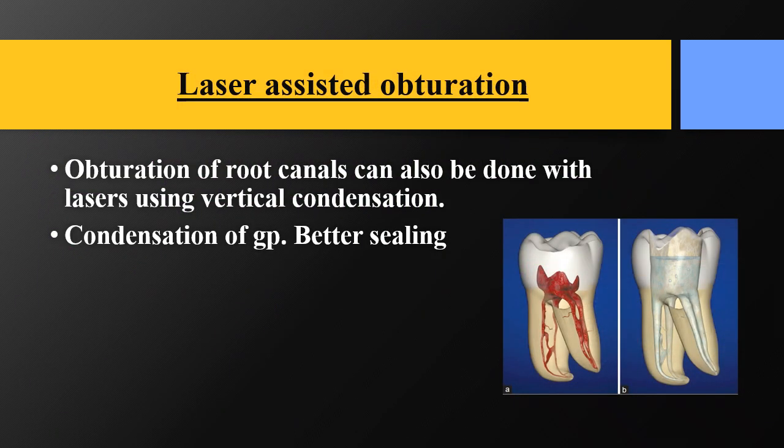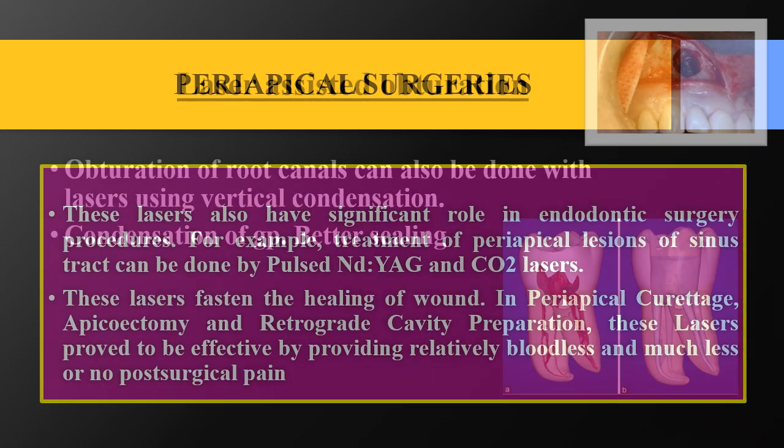Finally, there is laser-assisted obturation of the root canals, where the laser can be used for melting the GP and for condensation, giving better sealing property.